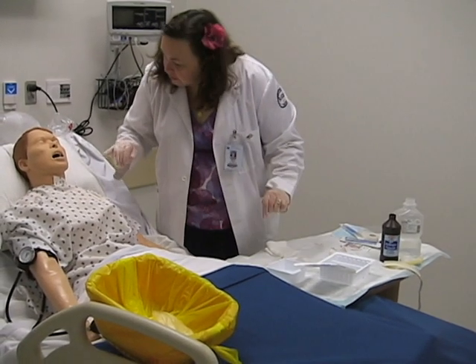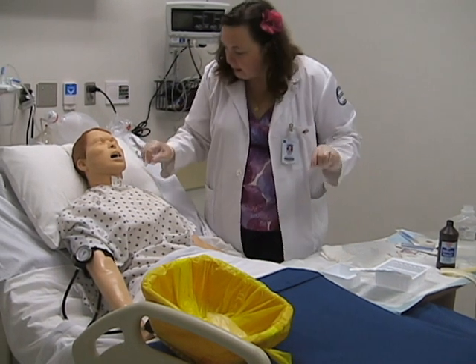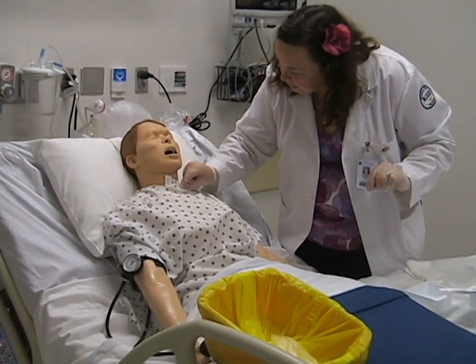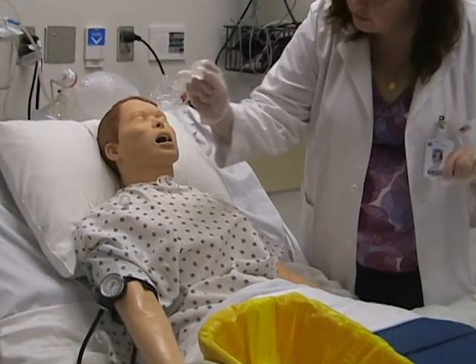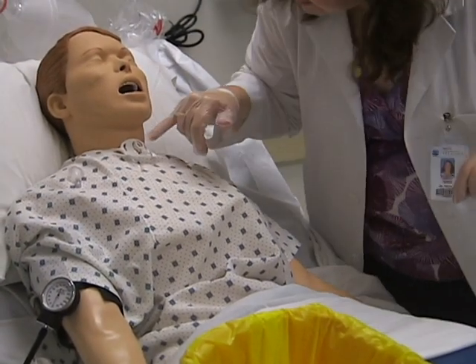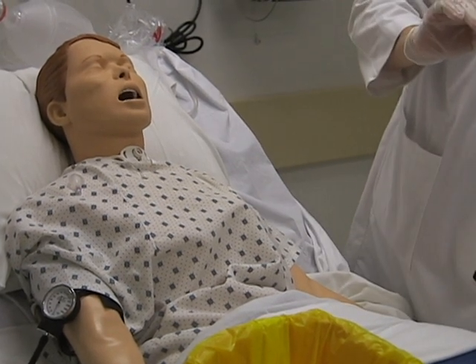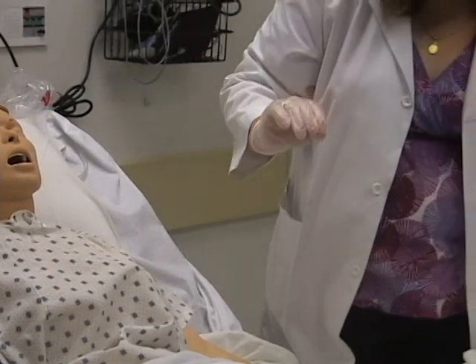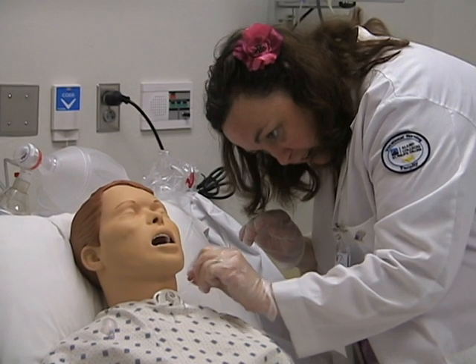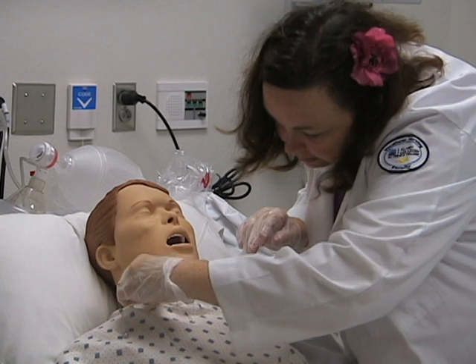Then I like to inspect the site. I'm going to remove the under-trach sponge and dispose of it. You want to make sure you look all around the stoma — make sure there's any redness, drainage, secretions, anything like that that could be going on.